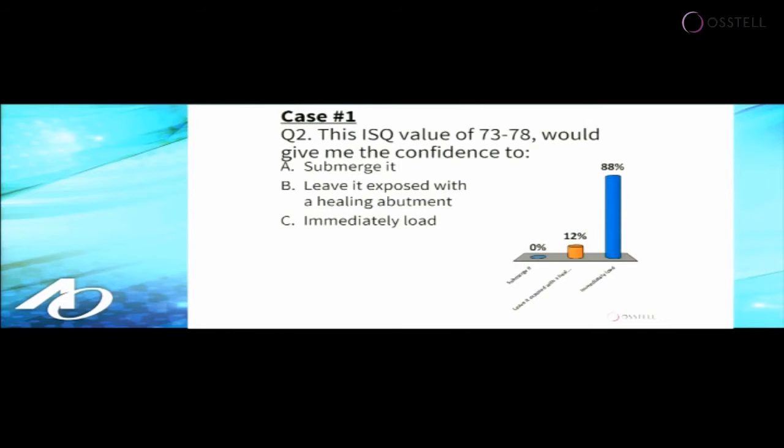I think the ISQ is part of the information that you need to evaluate when you're deciding on a loading protocol. Scott touched on some of that already, and just to reiterate, I think one of them is, how did you get to this point? Was you dramatically undersizing the osteotomy? You'd like to know tissue quality, the aesthetic risk or the aesthetic sensitivity of this particular patient, location in the mouth, your ability to control forces on this implant, because regardless of how it's loaded, it cannot move during the healing process, or you will ruin the osseointegration.